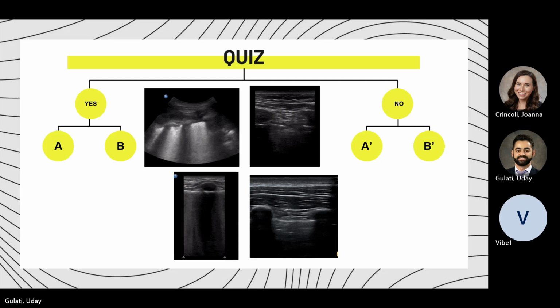And in this patient, I put the M mode and you can see that there's good motion throughout, and it was in fact a lung pulse. And so the answer here is atelectasis. There's a lot of atelectasis on the left side. These 4 images are from a patient who had a right main stem intubation. There's a lung pulse. Any questions on how I got that?